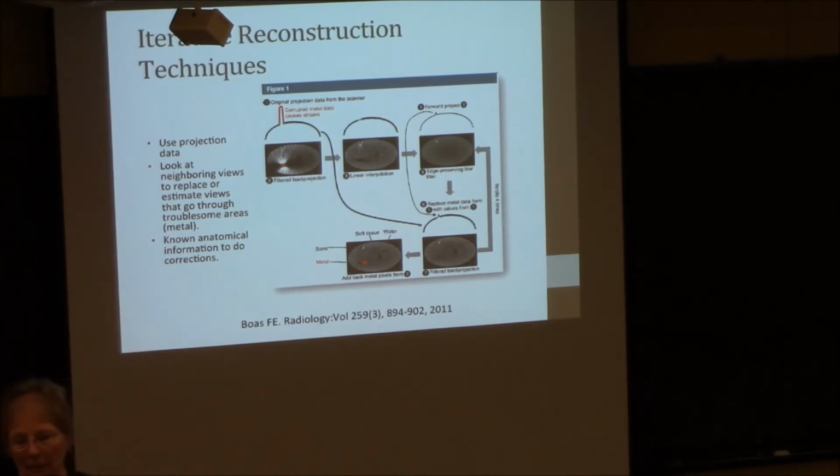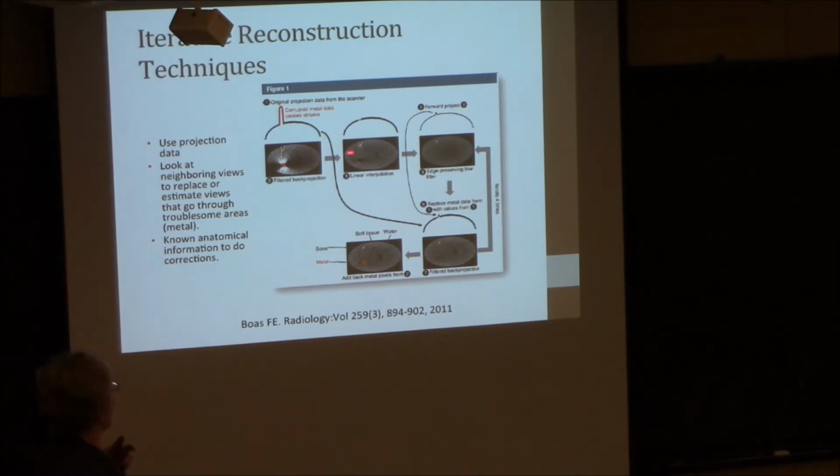And then the second thing, and this is something very new, is new reconstruction techniques. I told you earlier that in CT, if you have an area like in the middle of the body that basically absorbs all of the radiation, you get these sort of black wings on either side of it. That was very common if you have any kind of an implant in your body, any kind of metal, any really hard anything in your body. So an iterative reconstruction technique takes the data and does some interpolations of what the image should be, and depending on the technique, and most vendors won't tell you exactly what they do because it's all proprietary, they basically sort of forward project with a little bit of data and then go back and fix the data.